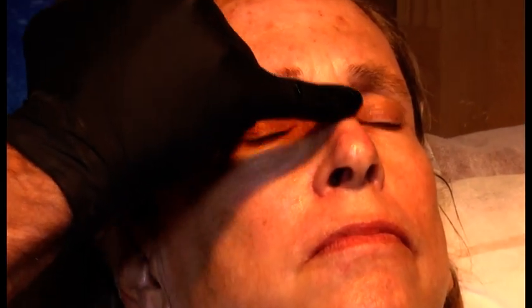We agreed that I would inject half of the face, and I will inject the temples. I will treat the quality of the skin with diluted Radiesse, 1-to-1 dilution Radiesse, and I will treat her nose augmentation.